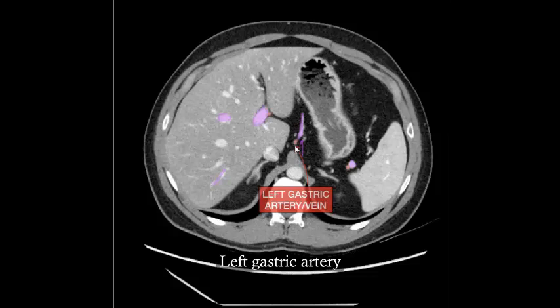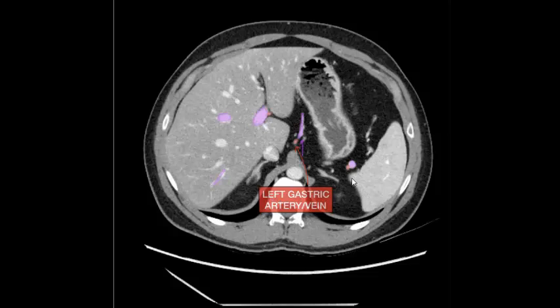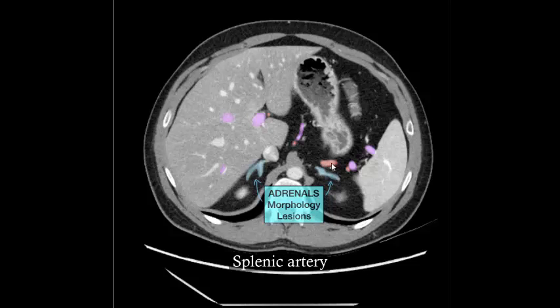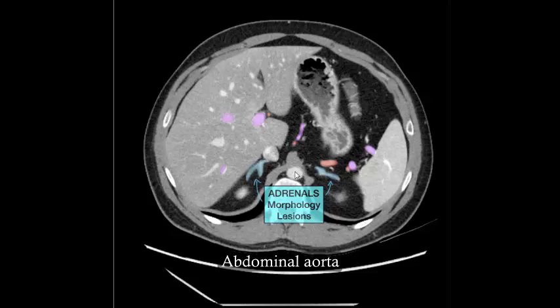Left gastric artery, left gastric vein, portal vein, spleen, splenic artery, splenic vein, stomach, spleen, right and left adrenal glands, splenic artery, splenic vein, spleen, inferior vena cava, abdominal aorta.